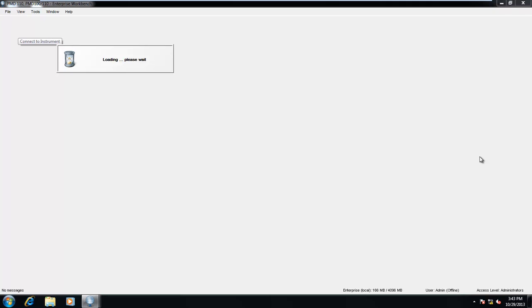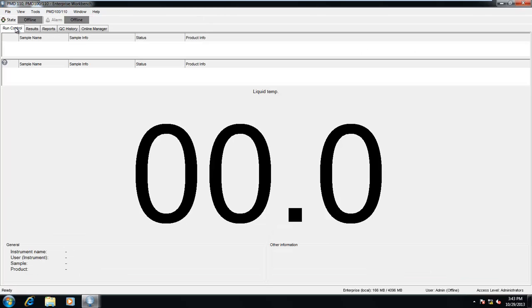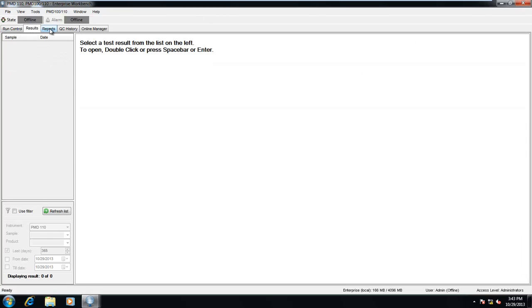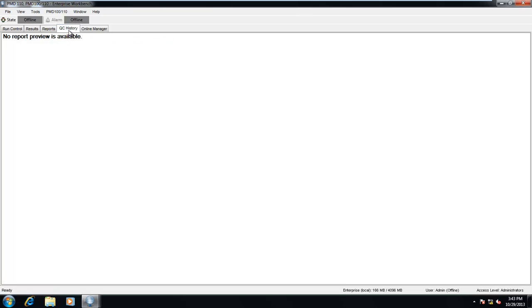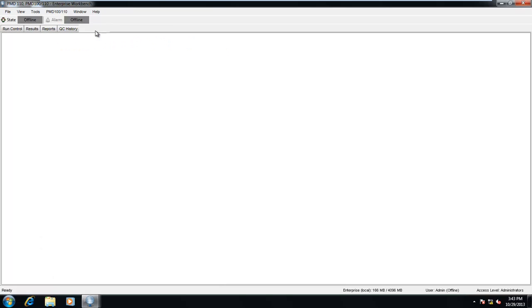Upon startup of the plug-in, our user will immediately notice a set of status indicators and tab pages available at the top of our window. These items are present in all IRIS plug-ins, and their functionality is consistent throughout the different modules. These will include run control, results, reports, QC history, and online manager.